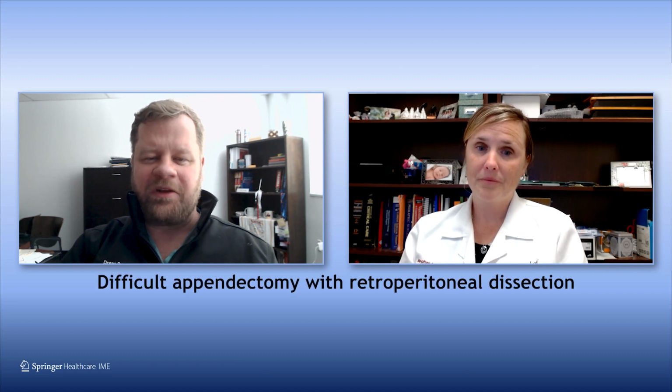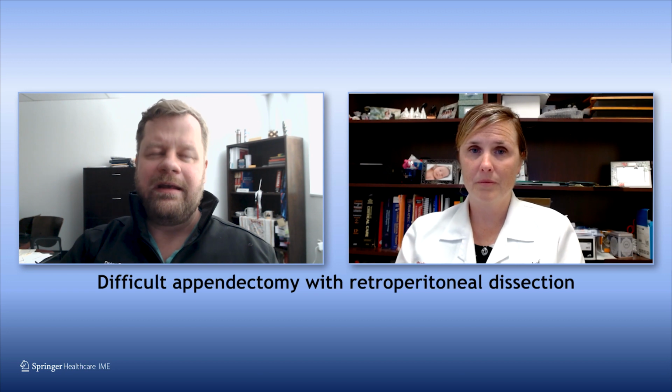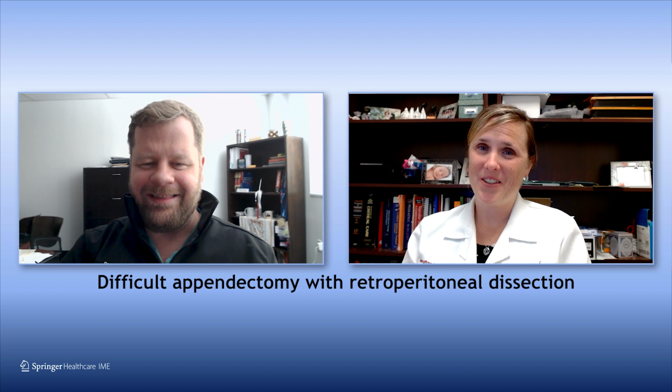What do you think? What kind of cases do you think would be interesting to discuss? Sure. So again, keeping in the mindset of the acute care issue, and either nowadays the inpatient or perhaps the outpatient setting, I feel like the difficult appy with that retroperitoneal dissection, if it's stuck and matted and the patient's had several days of pain and here we are, can be a real problem, because that retroperitoneal ooze and that sort of amorphous space, if you will, is an issue. And you would think it's just an appy. We can solve this bleeding. This should not be an issue. But these can come back to bite you. And so I'd be curious to see how you approach that if you've encountered that. And I dare say you've had a few difficult appies in your experience, as I know I have.